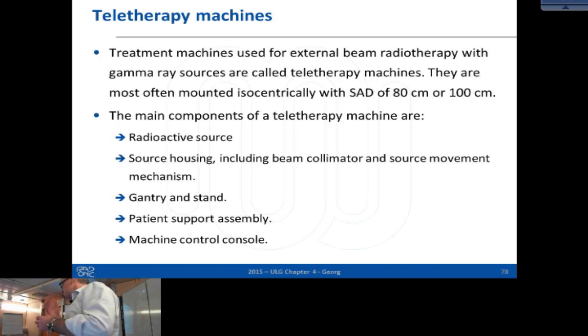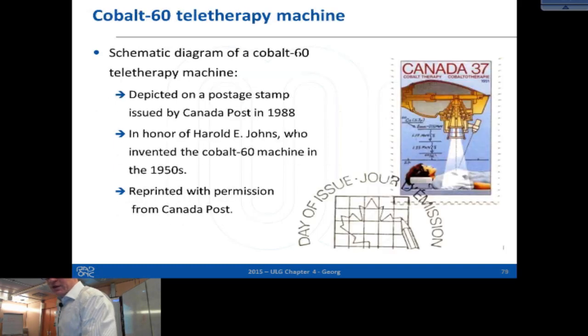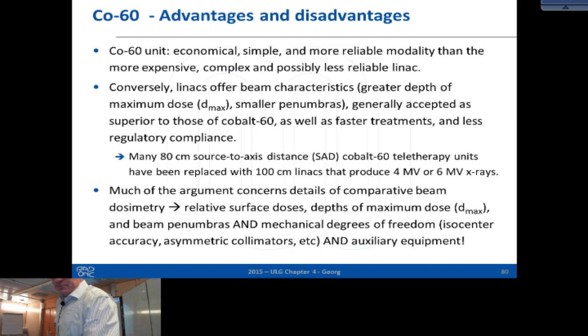We as radiation workers, also the RTTs bringing the patient into the treatment room, don't want to be exposed all the time to the gamma rays from cobalt. So the source needs a resting position that is sufficiently shielded so the personnel is not exposed to radiation. I will come back to the treatment head later.